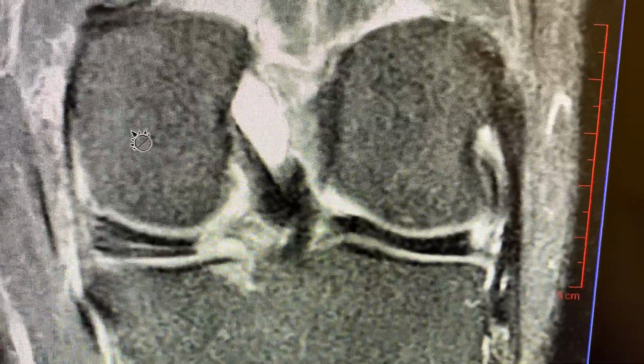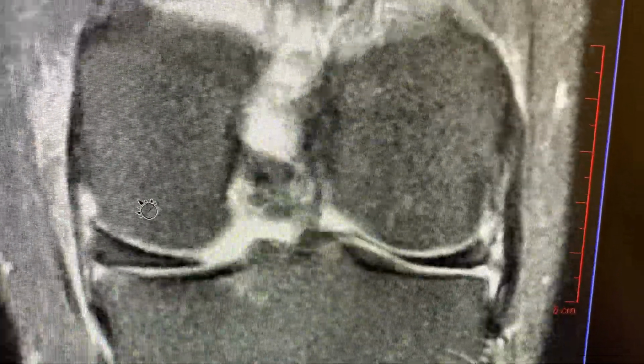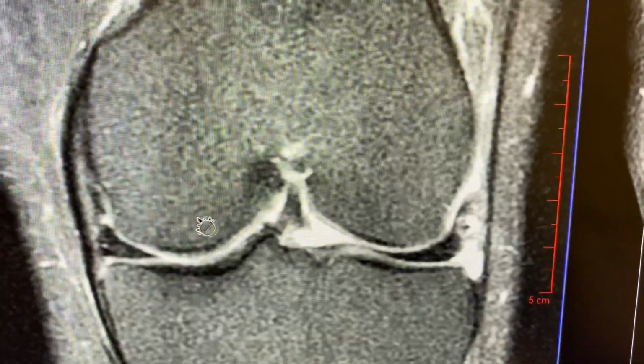Actually, I have a number of these today. This is a root repair of the knee. It's not my only one today. If you wonder why I do so many, it's because I look for them.